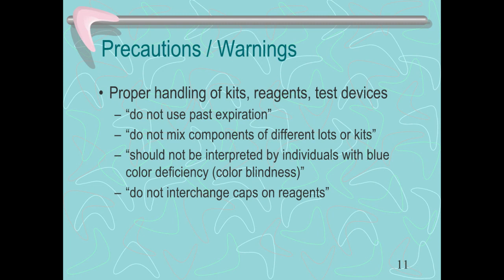Should not be interpreted by individuals with blue color deficiency or color blindness. So sometimes a pregnancy test may show up a blue line or two blue lines, so if you can't see blue, you can't really interpret that particular testing. And do not interchange caps on reagents, because even though one might be red and one might be black, you don't want to put them on the alternate one because it may not fit appropriately or someone may mistake them. So be sure that you put the caps back on from the reagent that you find. So that's some good examples of precautions and warnings.